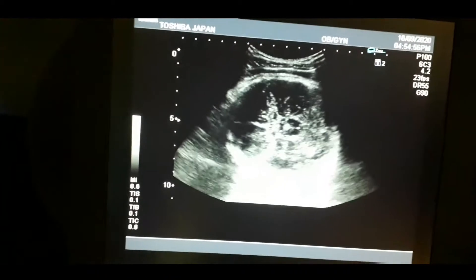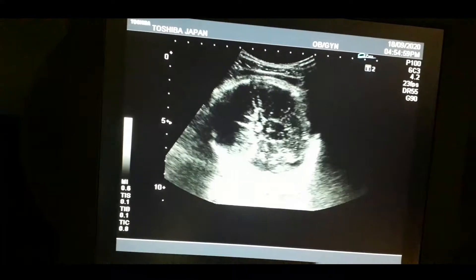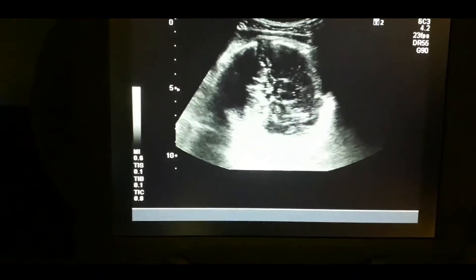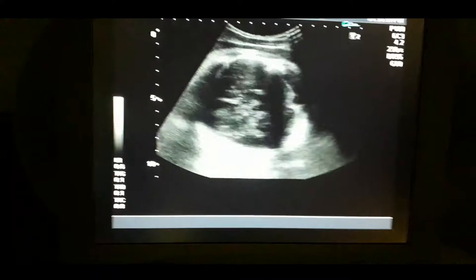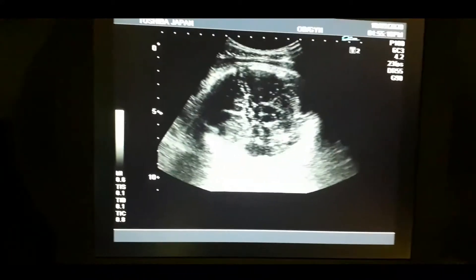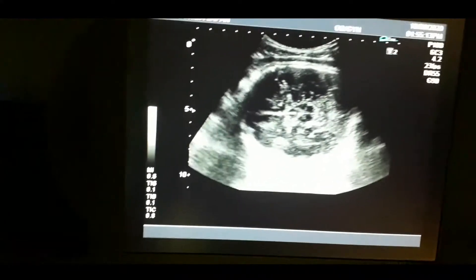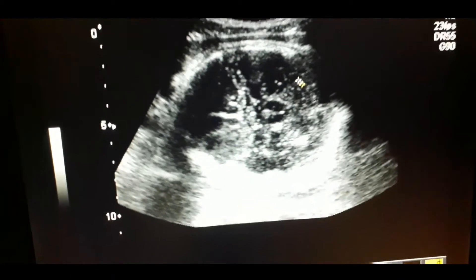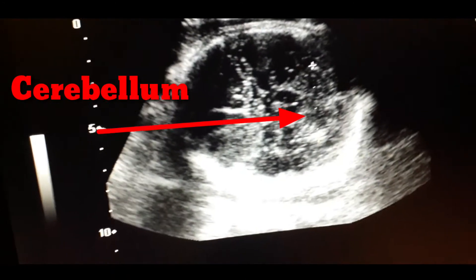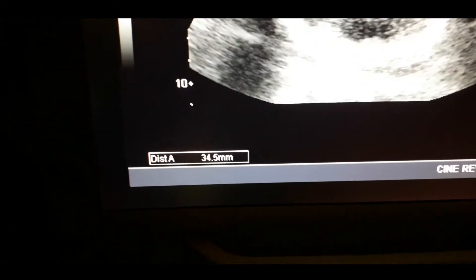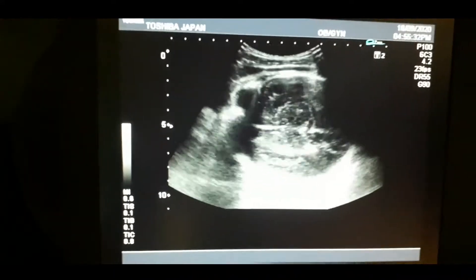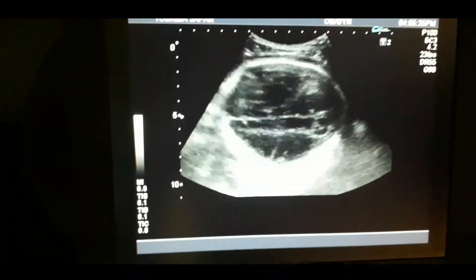Now we will focus on the transcerebellar plane and try to locate the cerebellum. The cerebellum sometimes helps to calculate the age of the fetus in early weeks of pregnancy. Now we are focusing on the cerebellum in the occipital region. We will measure its diameter — it is approximately 32 to 34 mm. This is the rough estimation of the fetal age.